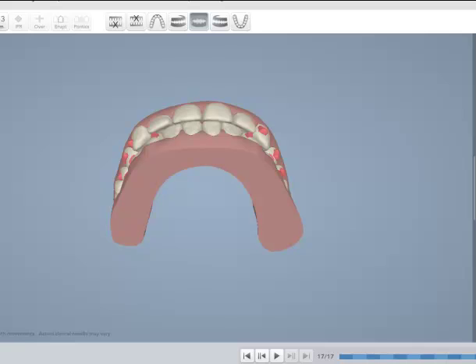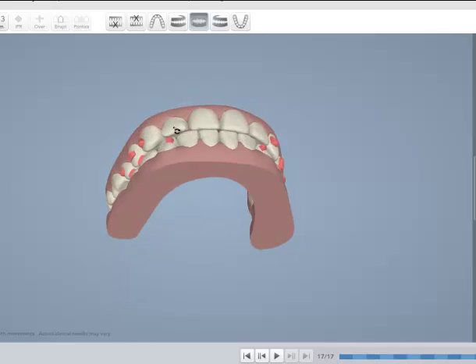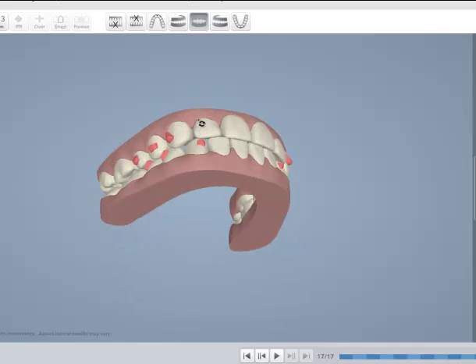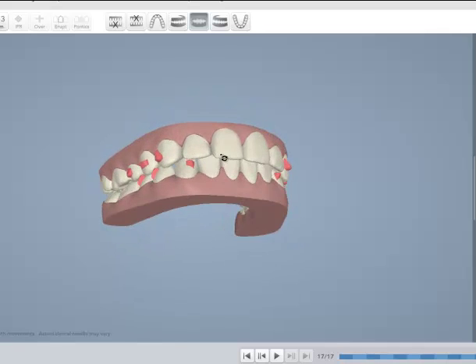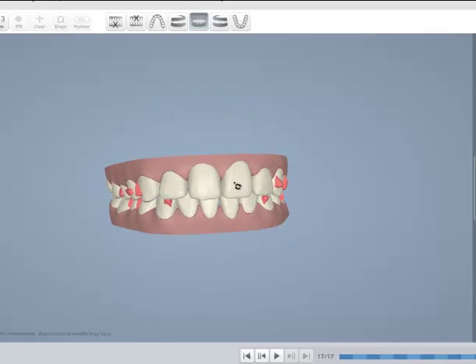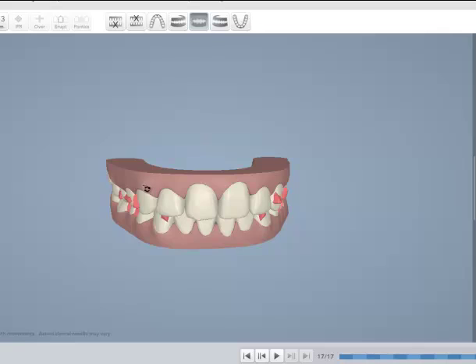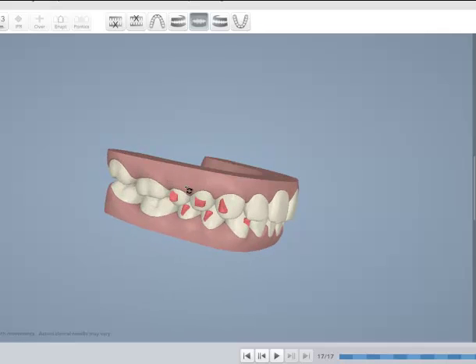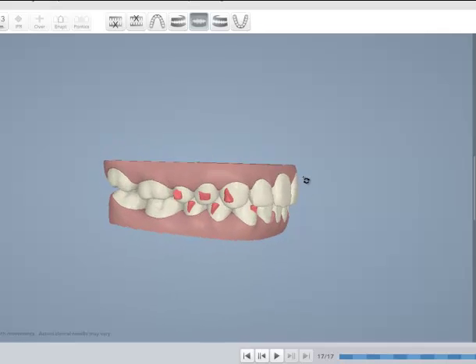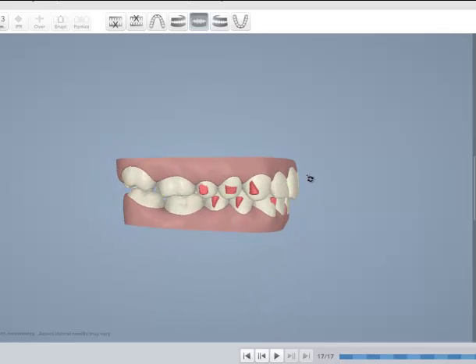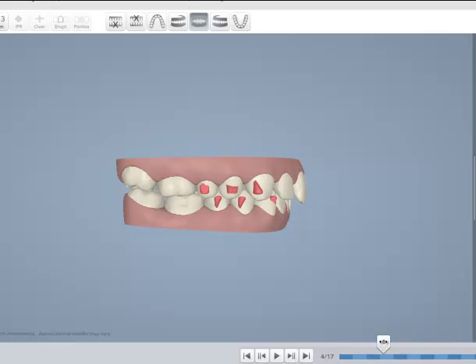You can see this is a fairly old ClinCheck, so at the time we didn't have the power ridges. Today, if we had to redo this ClinCheck, I would request that power ridges be positioned on the upper incisors.